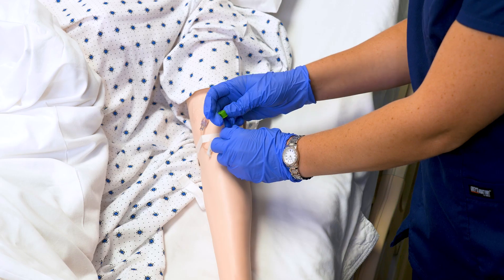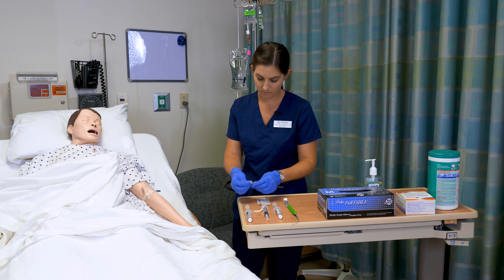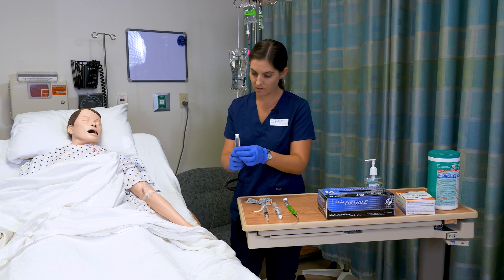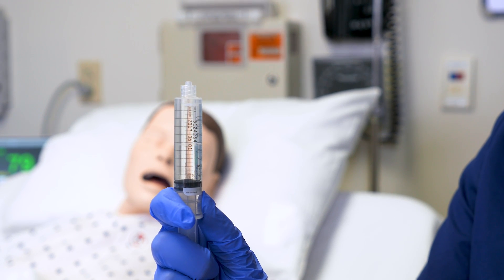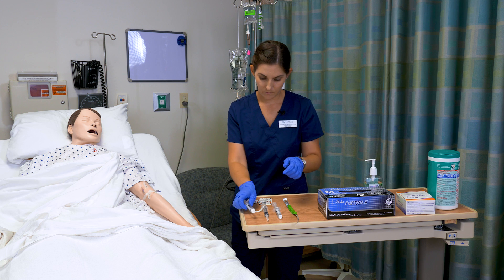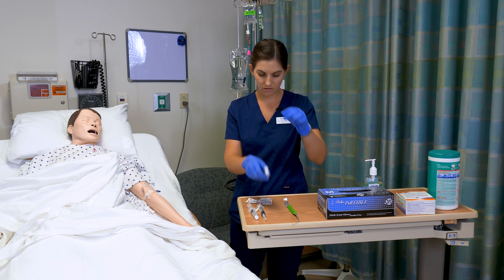I'm going to remove my old Kiro cap — that can be discarded in the trash. Before I clean the port I'm going to make sure I do not have any air in my first saline. Double check my med is good. Make sure my second saline looks good.